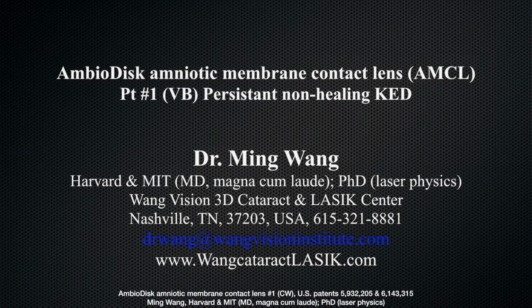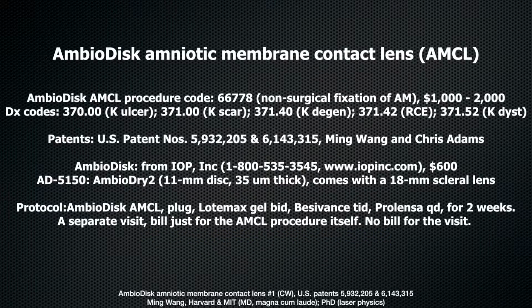Typically, we leave the amniomembrane contact lens in the eye for 2 weeks. So again, this is Dr. Ming Wang. I have described the clinical protocol of using AmbioDisk amniomembrane contact lens for persistent non-healing corneal epithelial defect. AmbioDisk amniomembrane contact lens carries a procedure code of 66778 for non-surgical fixation of amniomembrane. And the reimbursement on average in the United States is about $1,500 for this in-office procedure.